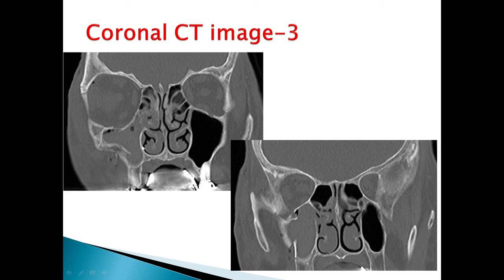The coronal CT image depicts the fractures very well. We can see there are acute comminuted fractures of the posterior, lateral, and medial walls of the right maxillary sinus with hemosinus. We can also see a fracture of the right orbital floor, and a non-displaced fracture of the right lateral orbital wall with some air loculi within the superior aspect of the right orbit.